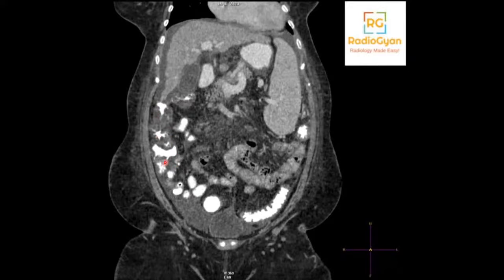What happens is that when there is liver cirrhosis, the liver doesn't function optimally. So the unprocessed metabolites reflux back from the portal vein. And because of portal hypertension, there can be centrifugal flow. And the portal vein mainly drains the right half of the colon. That is why you may get thickening involving only the ascending colon, because of these unprocessed metabolites causing inflammation in the colonic wall. So the complete diagnosis is cirrhosis with portal hypertension and portal colopathy.